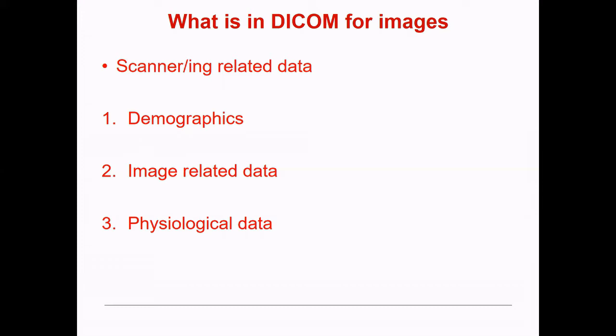Some medications are also put in the DICOM header. We don't put chemotherapy in there, but there is anti-allergic medication that we sometimes have to give when we give contrast agent for the exam. That gets put there, and the contrast agent itself gets inserted in the DICOM header as well. And then when we do those scans, we sometimes measure the breathing pattern or the heartbeat to trigger the exams on the heartbeat. And then these physiological measures also get written into the DICOM header. So in a sense, when you first look at it, it could be quite boring to just have the imaging format. But actually, quite a lot of things can be in a DICOM header as well. So if you need data that you would find difficult to get, then the DICOM header could be a surprising source of data.